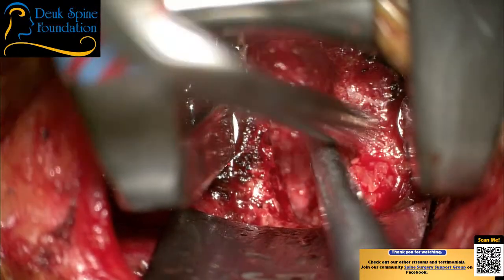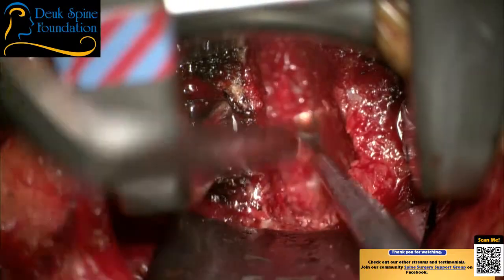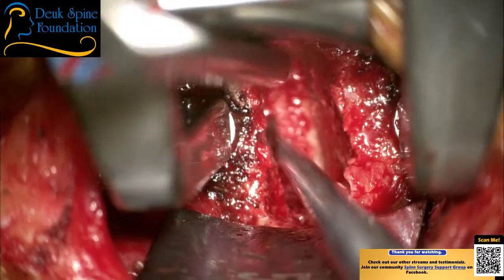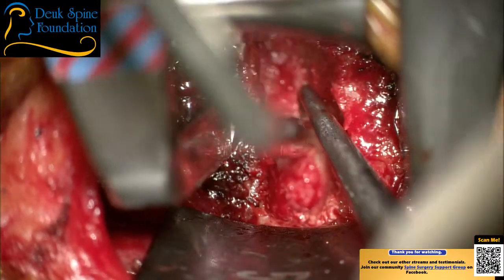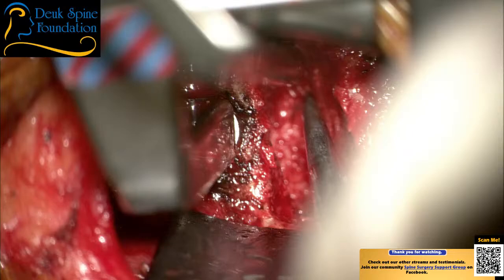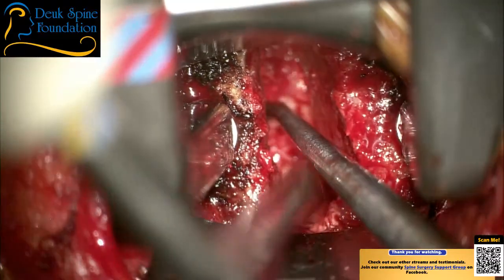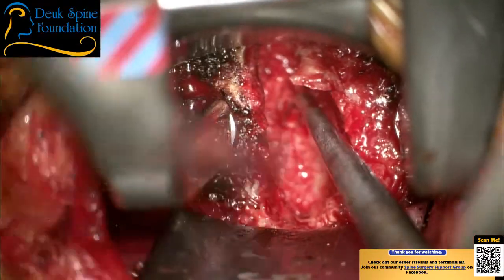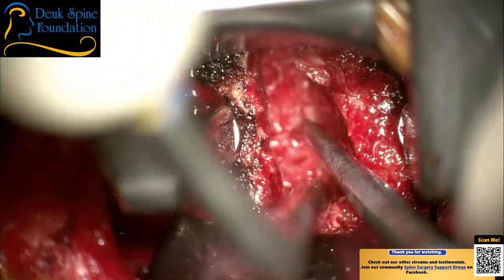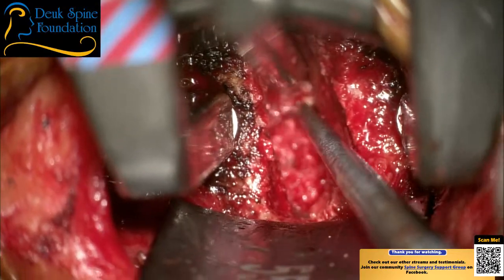All right, let's see here. Suck, suck, suck. Let me see here. Gentle. That looks like probably it could be dura. Suck for me. And it's very common for this stuff to get stuck to the dura. We don't like that, but that's what it looks like. Let me see here, Patel. I need you to suck right there. Come on. Help me out. Suck. It's really hard to tell. What we want to do is get the pressure off the dura.